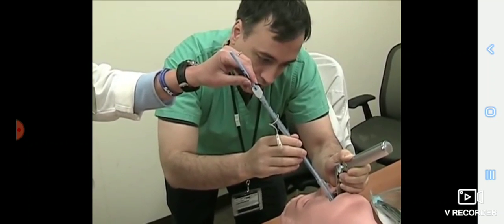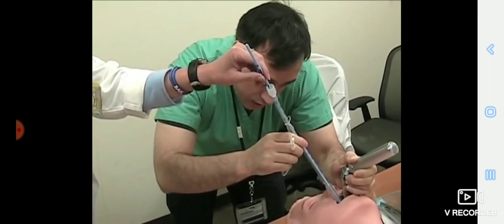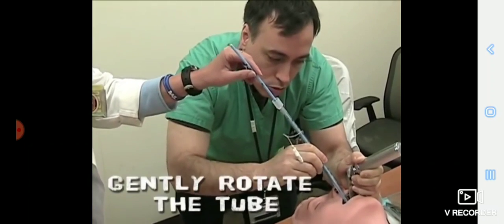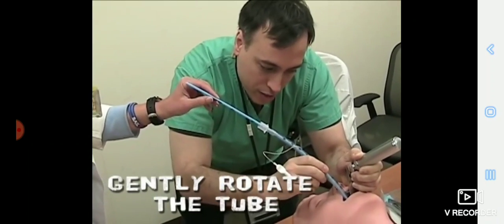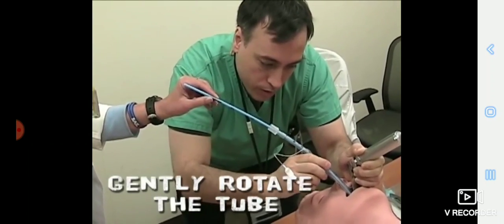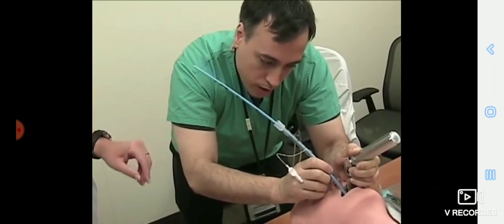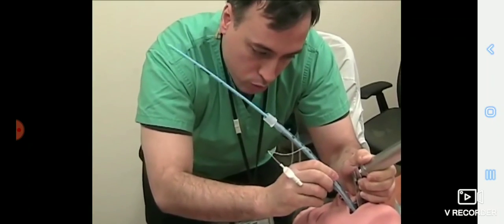Just given the shape of the endotracheal tube, oftentimes it'll hold up on some of the cartilage, or it'll just get caught on the cords. What you want to do is just rotate the tube counterclockwise 90 degrees, and then gently go back and forth and rotate ever so slightly, and eventually the tube will pass. As long as you're gentle, you're not going to cause any airway trauma. If you try to jam this thing in, that's when you run into problems.